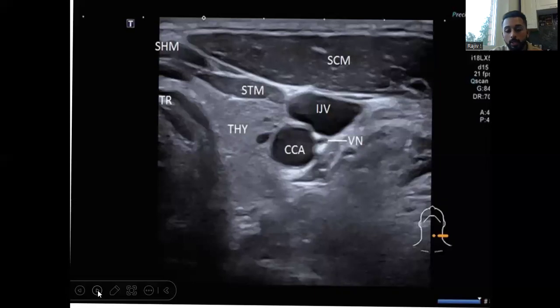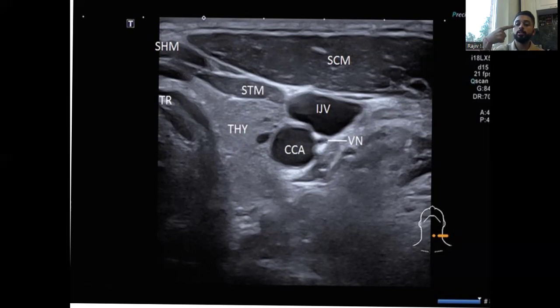Next thing is a little brief what you'll look in the ultrasound when you're going to perform the local anesthesia or the regional anesthesia. On the top, you will see sternocleidomastoid muscle. This is the internal jugular vein, which gives a branch that is facial vein. Now, facial vein is the most important landmark when you are going for the surgery. So facial vein lies like this, and then here is the carotid artery. So facial vein is above the carotid artery.